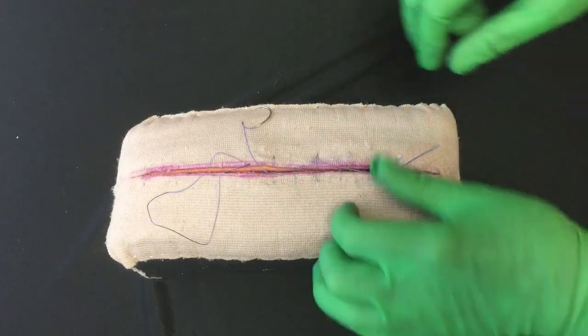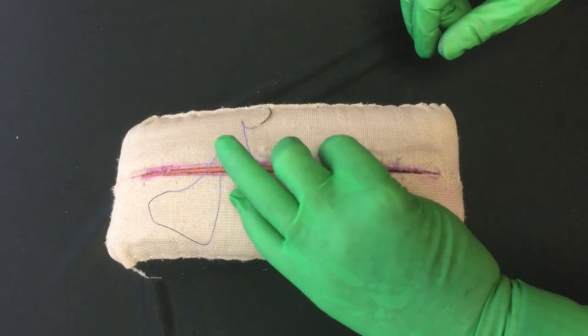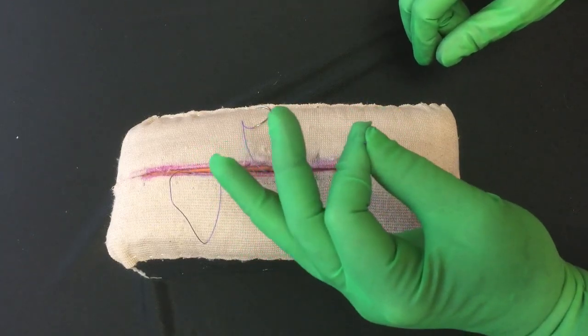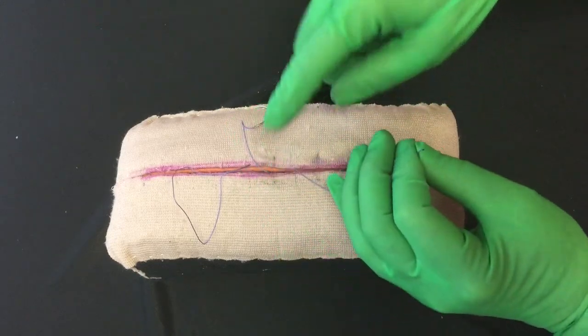So you take your stitch which is probably long on this side. I like to put it with palm down and I pinch it between my index finger and my thumb, and then my little finger is going to be next to the incision.